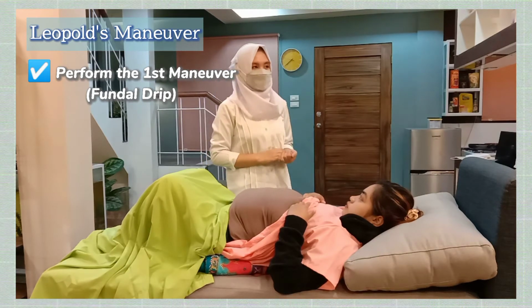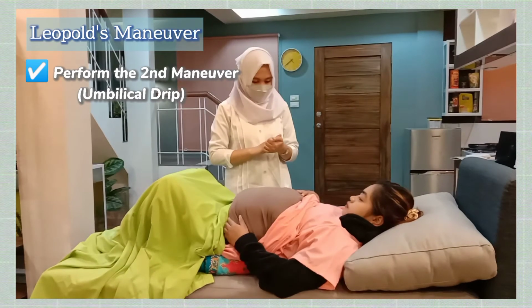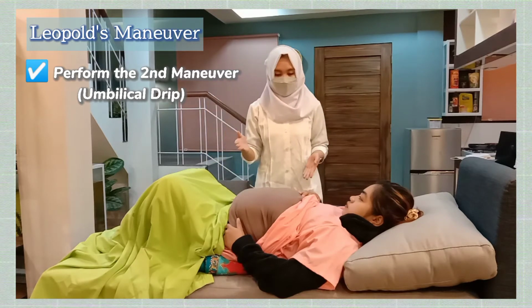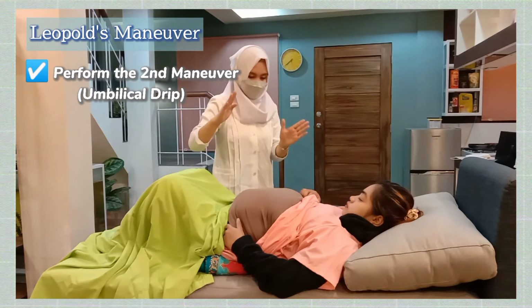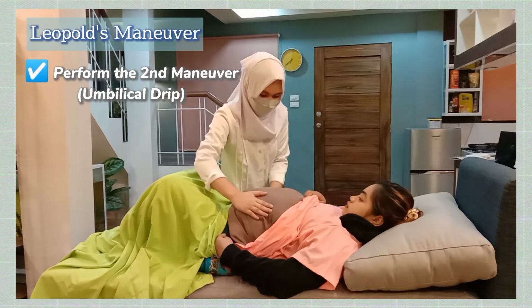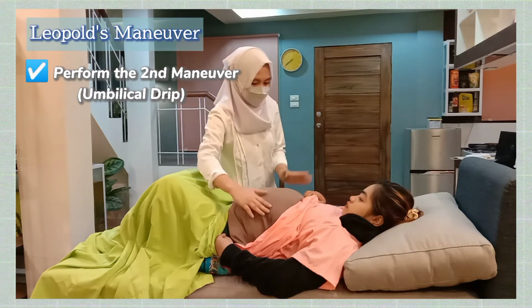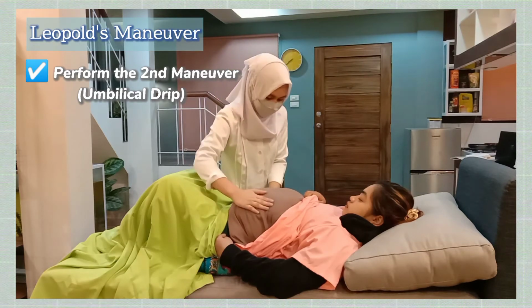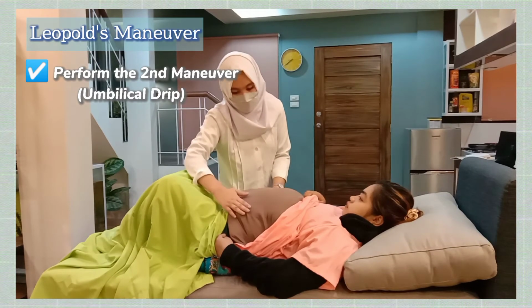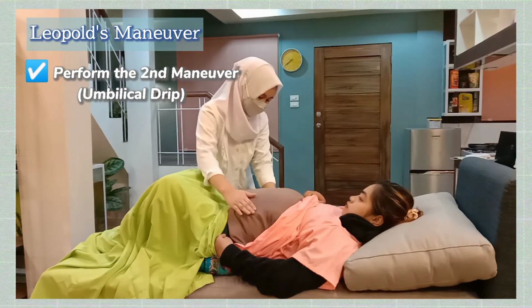Now, we will begin with the second maneuver, or the umbilical grip. It is to determine where the back of the baby is. I will use both of my hands and place them on both sides of your belly. This left hand will be used to support while my right hand will be used to palpate. I'll start palpating from the top to the bottom. Now I will do it on the other side.